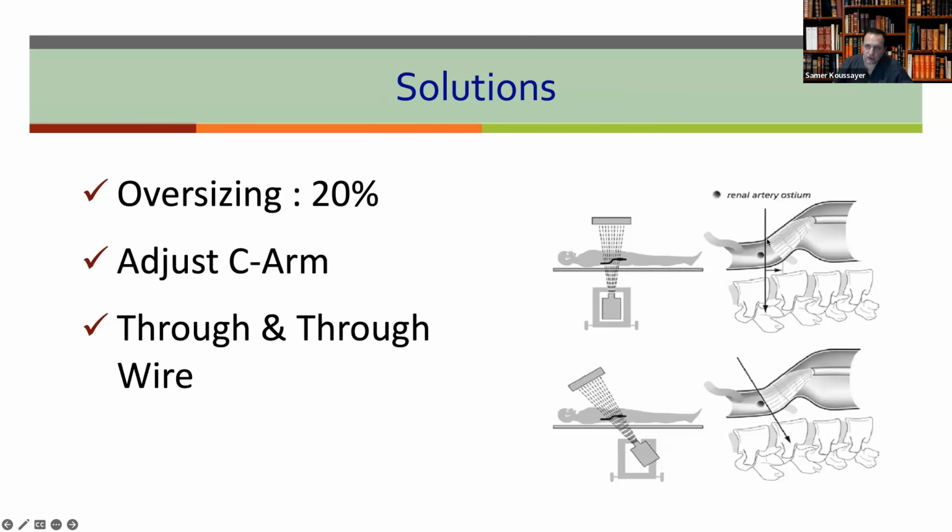Because in angulation you need to go lateral, so you can be sure you took the whole length. If you go AP, you lose a big length of the neck. The reason I'm saying that is, when you're dealing with angulation, you need at least 15 to 20 millimeter neck, because you're going to lose a big part of the neck when you deploy it.